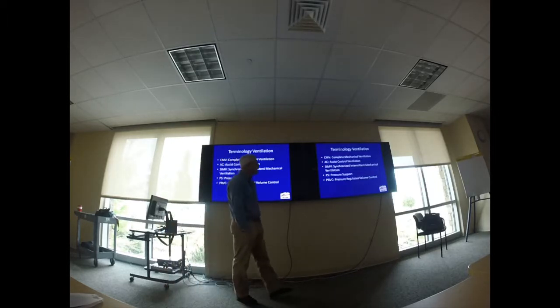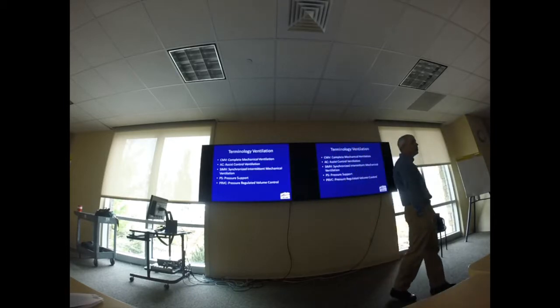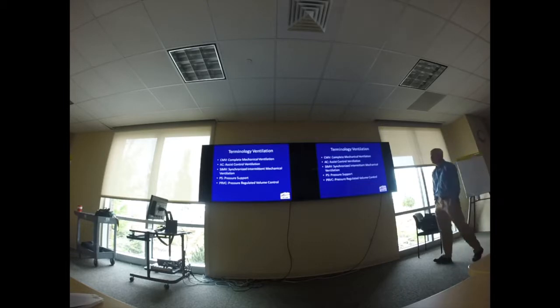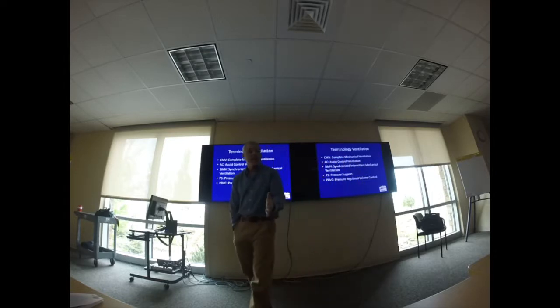Synchronized intermittent mechanical ventilation is another mode of ventilation that you guys have available to you on the Revel. And what it does is it allows the patient to take their own breath. So again, using a volume mode of ventilation as an example, I've got it set up to deliver 12 breaths at 500 mLs.